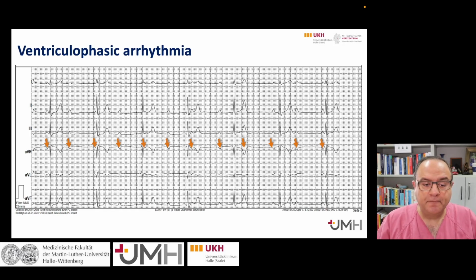We can also explain this finding, ventriculophasic arrhythmia, with negative chronotropic effect, which is defined as sinus rate deceleration affected by ventricular contraction, and its mechanism involves a vagal reflex caused by the stimulation of the arterial baroreceptors system by the pulse wave front of the ventricular contraction.